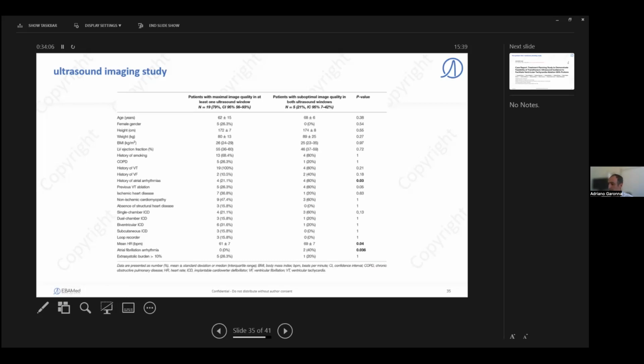For these patients, CT acquisition for simulation would also be hindered. You would have to do a specific protocol, including medication to temporarily suppress these arrhythmias, or pacing methods to control the heart rate. So we share the same challenges that you would have for imaging for simulation. But outside of AF events, the image quality is good enough for us to perform guidance.